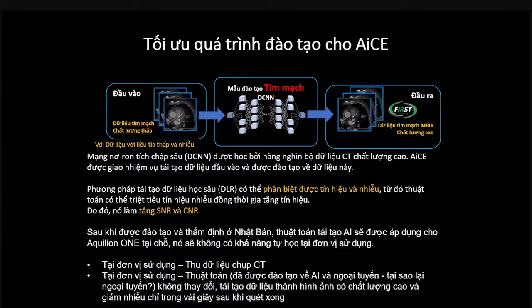The input is low quality, so-called low radiation dose scans with noisy data. The model is trained and the output is high image quality.